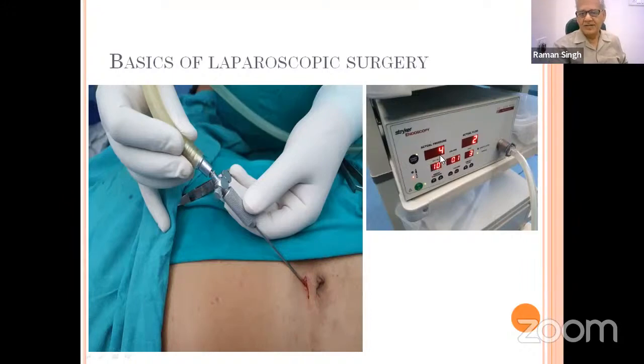And this is 4. It indicates the present pressure of the abdominal cavity, this indicates the rate, and this indicates how much carbon dioxide is inserted in the abdominal cavity. Usually, there are three things introduced into the abdominal cavity to create pneumoperitoneum. The most common is carbon dioxide. Second is nitrous oxide, though I have rarely seen it used in the abdominal cavity. And third is air. Sometimes the cylinder is empty and we have no other cylinder. At that time, air is inserted into the abdominal cavity through this pipe, and we finish our laparoscopic surgery.